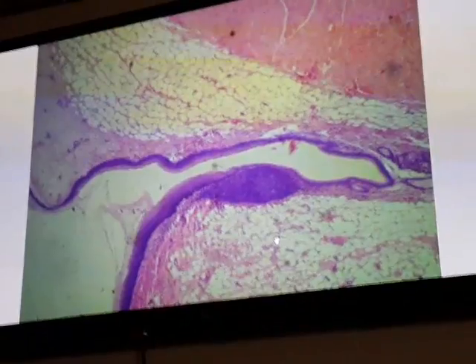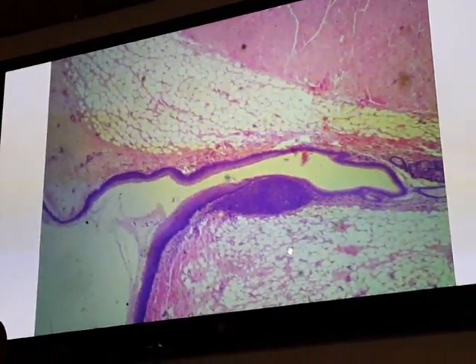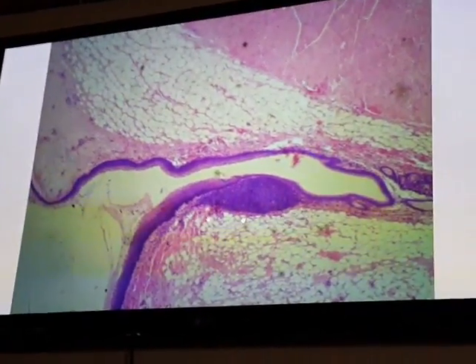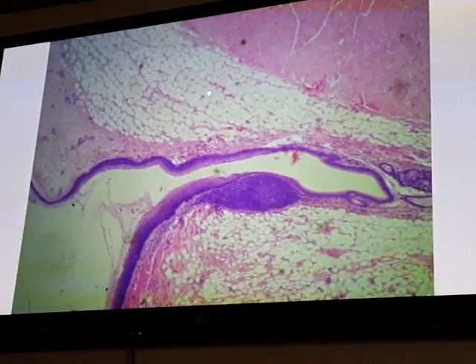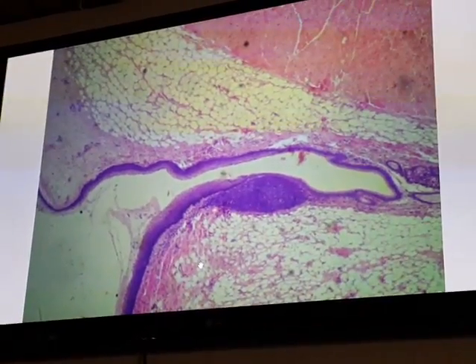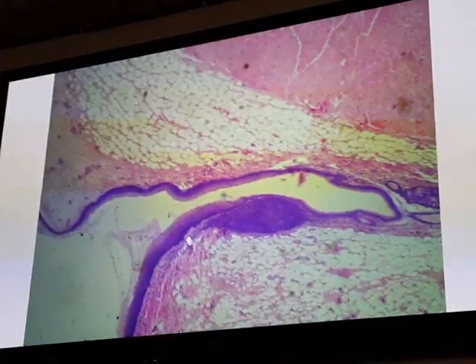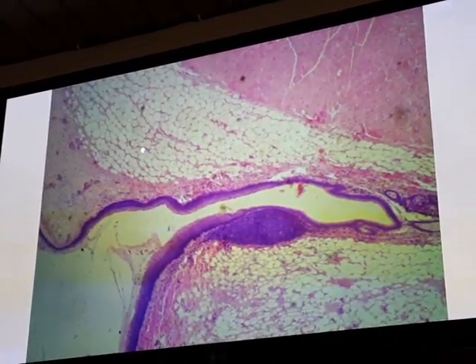In the larynx, we can see two pairs of folds that project into the lumen. This is the upper fold, and this is the lower fold. The upper folds are false vocal folds, while the lower pair of folds are called the true vocal folds.